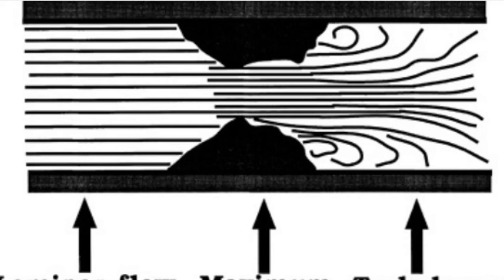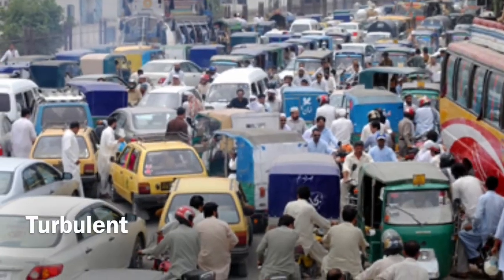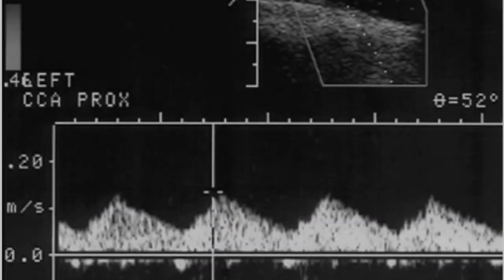Another point when understanding blood flow hemodynamics is that blood flows in a laminar pattern in normal blood vessels. Turbulence occurs at or distal to areas of stenosis. This is manifested in Doppler by mixed colors and broadening of the spectral wave.